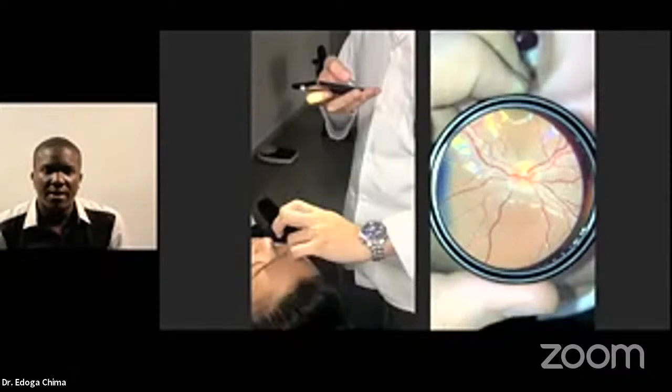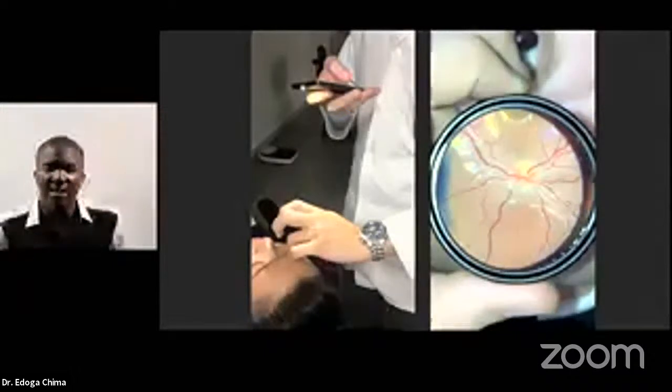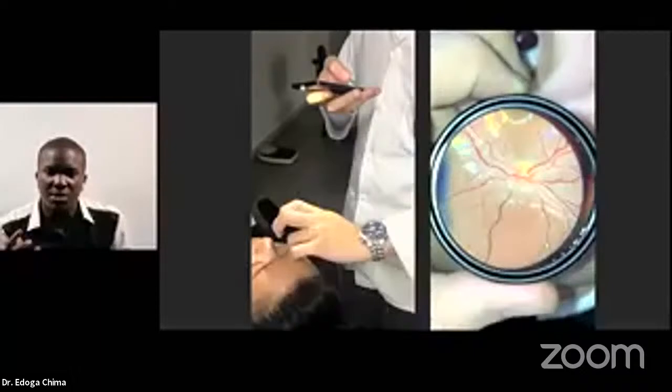The reason for this is that we initially talked about the two reflected lights that come out in the image. So when you have multiple lights in the room, you're going to have multiple points of light.